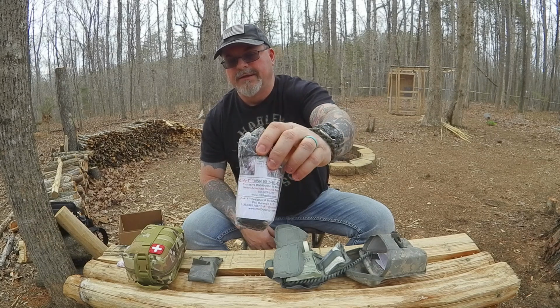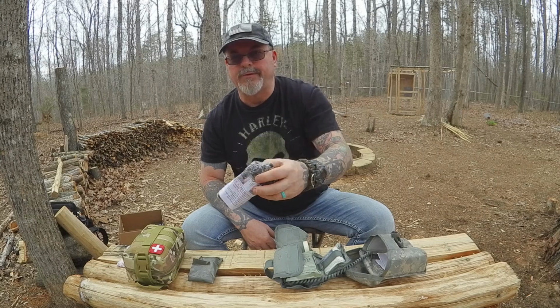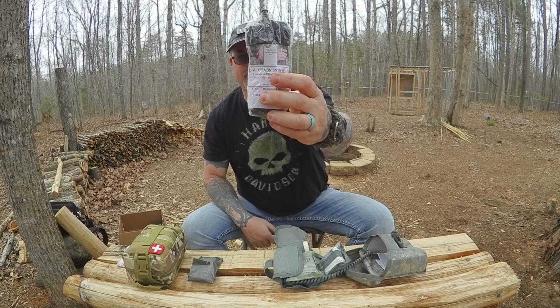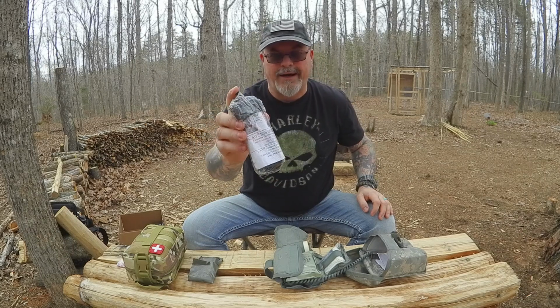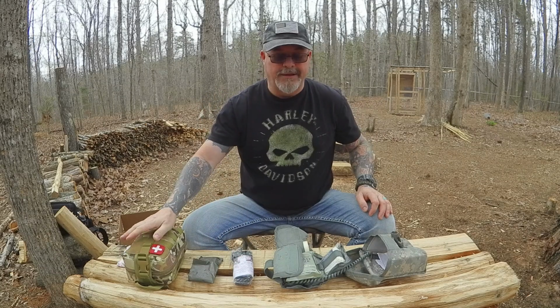But this is a CAT tourniquet. If you guys don't know how to use one of these, it's pretty simple. You put it around there, you tighten it up, you twist the bar, and then there's a way to lock it so it locks on there. And there's instructions on how to do it in these things as well. But there's a tourniquet in here. These are great little tourniquets, and we're going to compare apples to oranges once we get into this as well on tourniquets, from what comes in this one and that one.